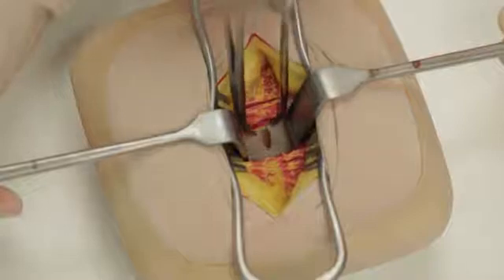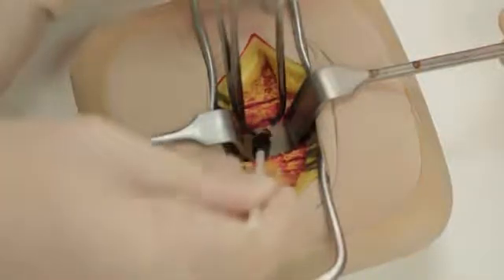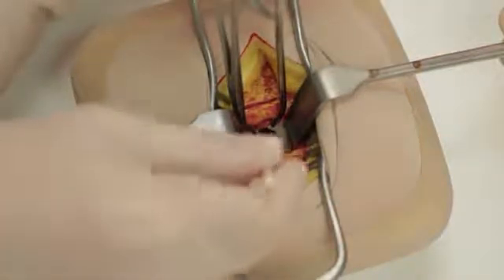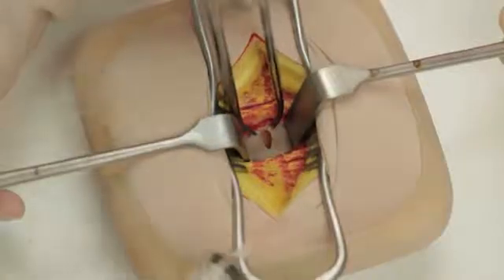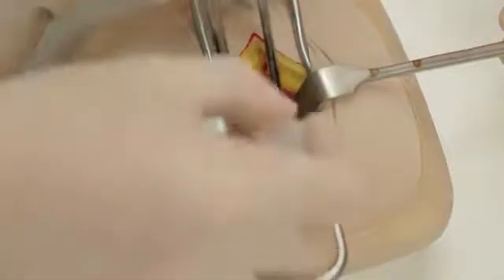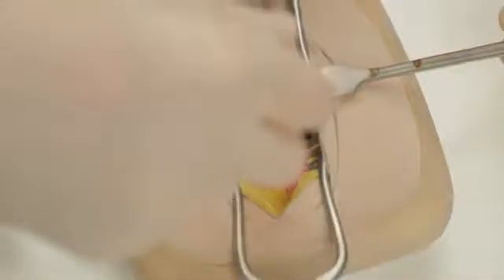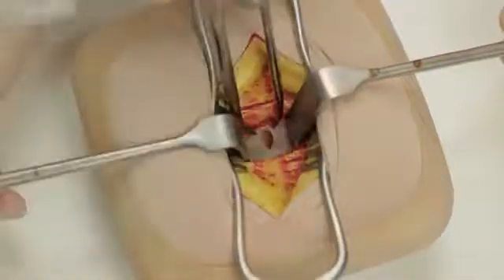If there is free fluid or pus, take a swab or alternatively collect a sample of fluid using a syringe. Look for any bile-stained fluid which may indicate a perforated peptic ulcer.